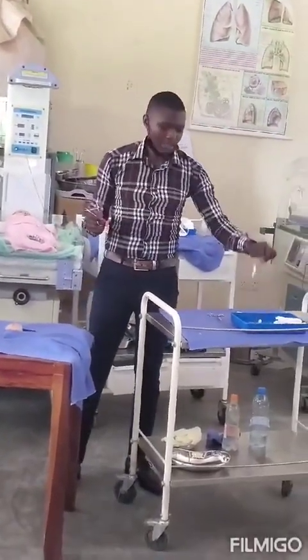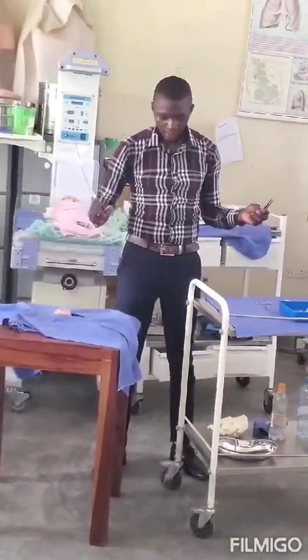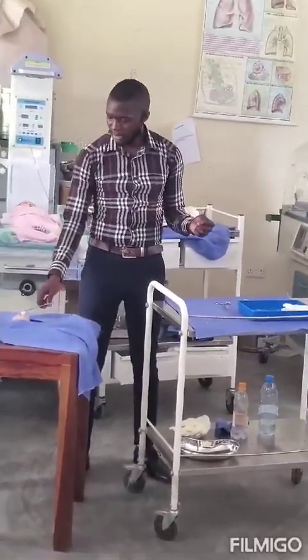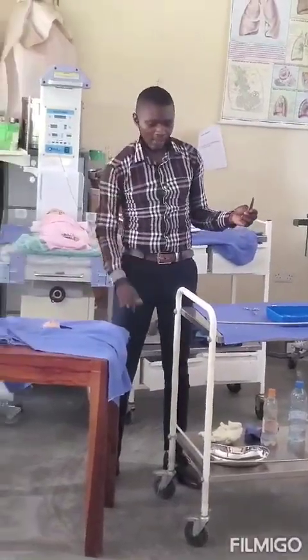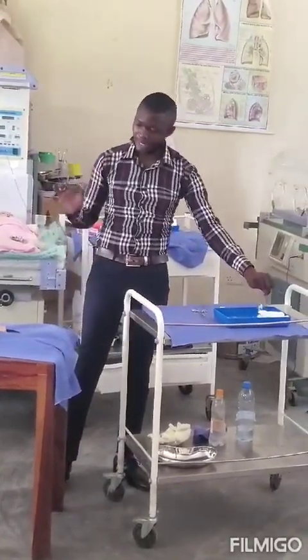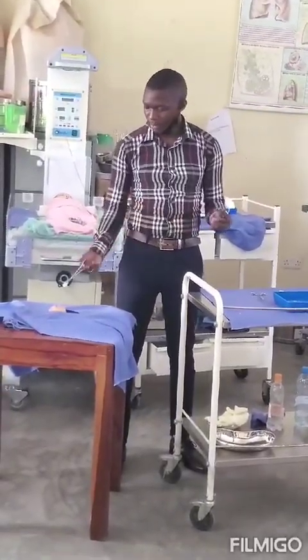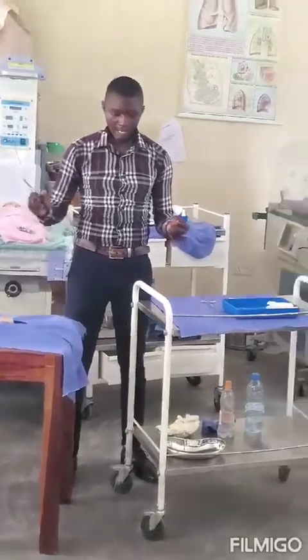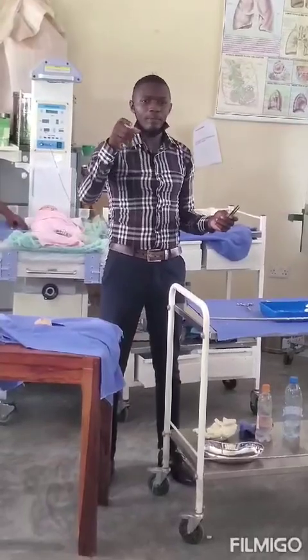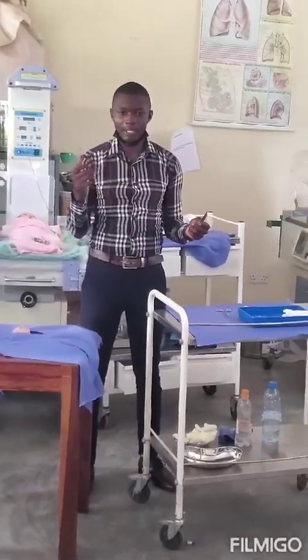So at this point, do wound care, get the first swab, pass it on, and wipe the furthest edge of the wound, discard it, get the second swab, wipe the closest edge of the wound, discard it, and throwing, there's nothing like this because you go below your waist. So you throw without the hand going below the waist. Then get the third swab and then wipe the middle of the wound and then discard. So at this particular point, this forceps is now ready to be discarded. So you will throw it in the receiver that you had poured chlorine in.